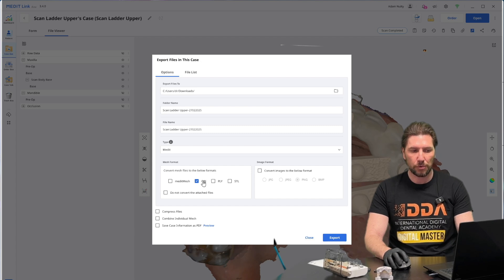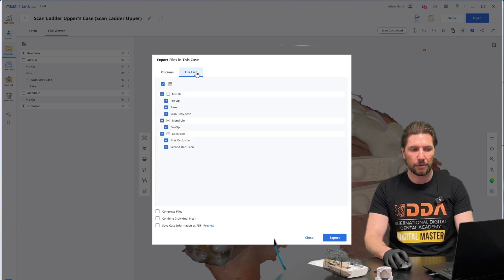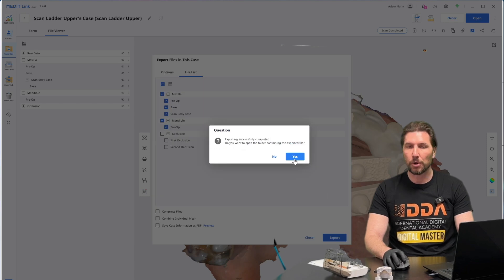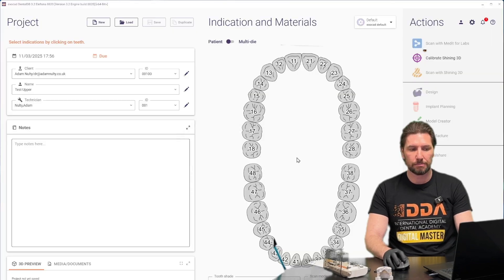For this case I'm going to choose an OBJ file, and in the file list we don't need the occlusion but we do need these other parts. So we're going to click export — and yes, we do want to open that folder.